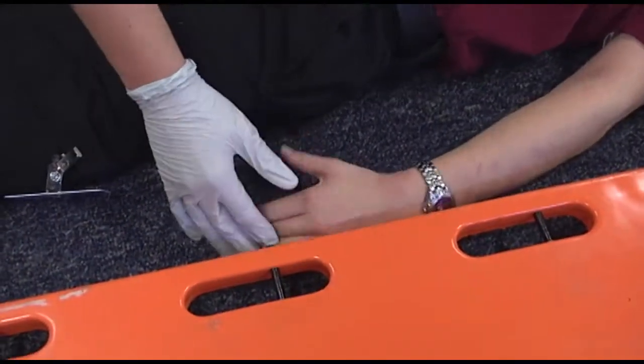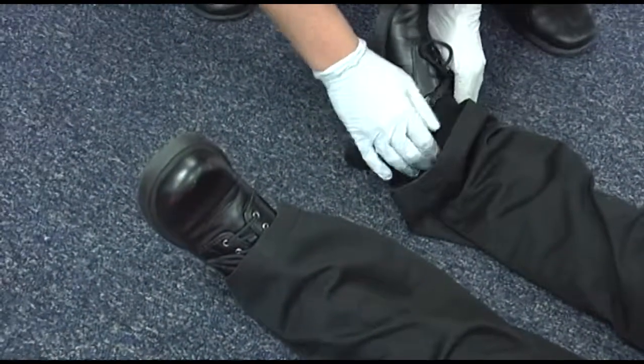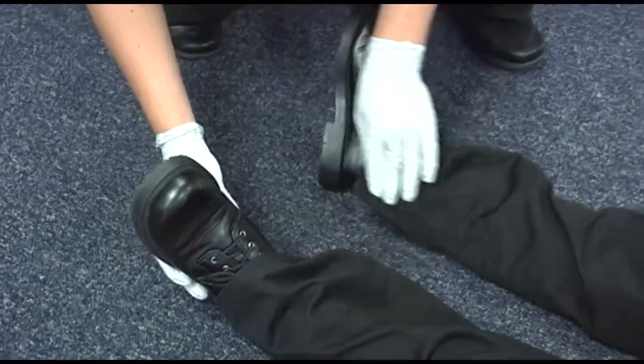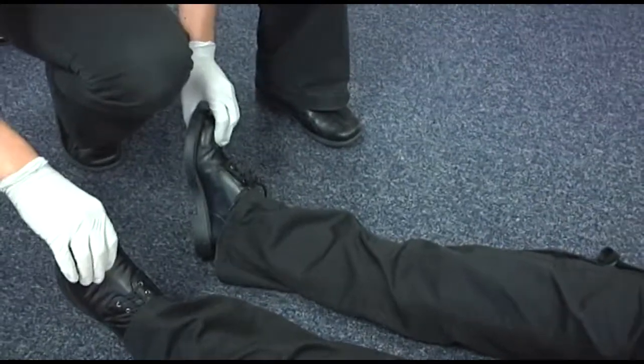Let's go through and check. Can you wiggle your fingers? It hurts, so we'll have to tie the legs together. Can you wiggle your toes? Yep.